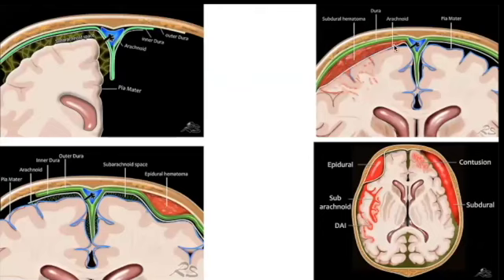Most commonly, we see this in a patient who has a rupture of an aneurysm, and most commonly, we see this in a setting of trauma. So as I said, in radiology, the history really matters. So you might suspect a subarachnoid hemorrhage in the setting of trauma. We will also be discussing it in detail in quite a few moments.